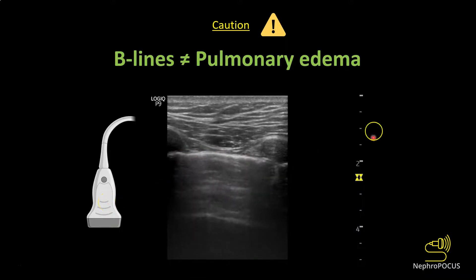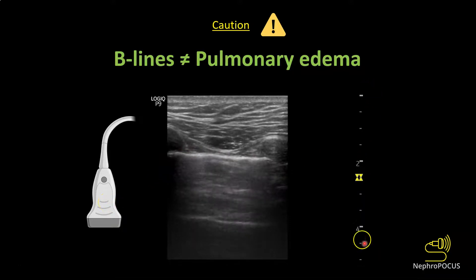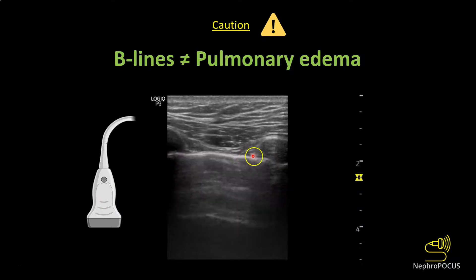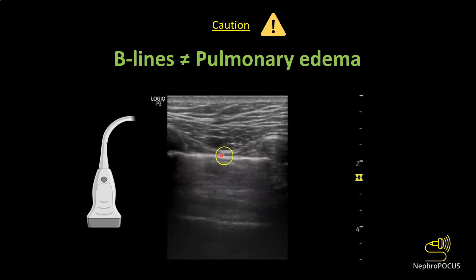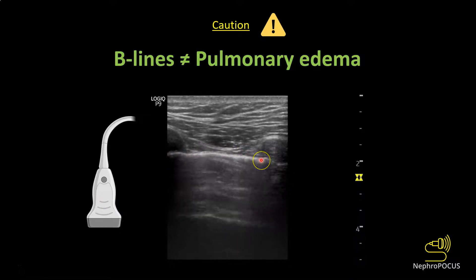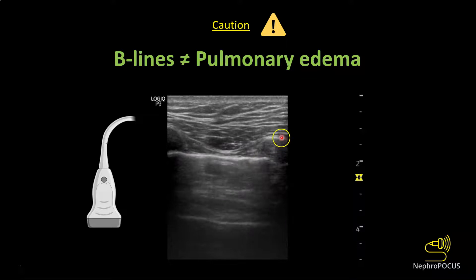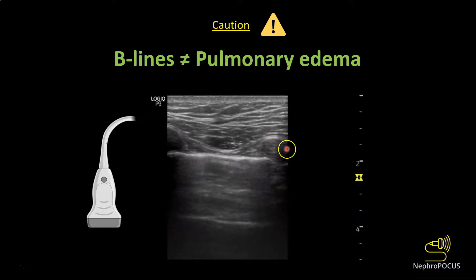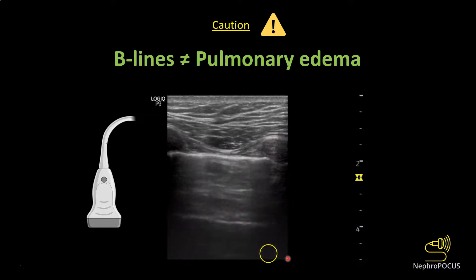If you want to assess pleural characteristics more closely, use a linear transducer or vascular probe. With less depth and higher resolution you can see the nice shimmer of the pleural line. This is a normal pleural line which is sliding; these are ribs with rib shadows, and you can see one A line here.